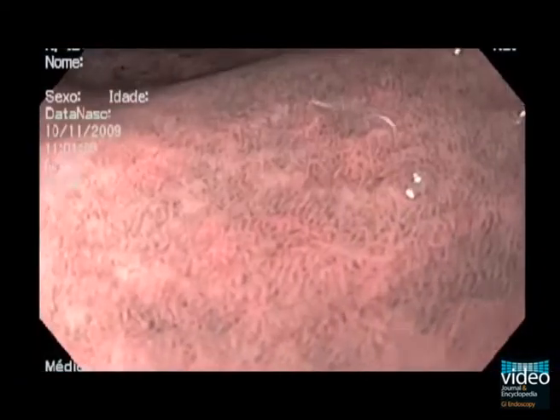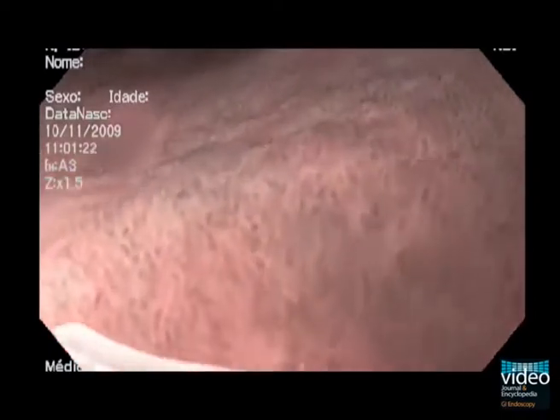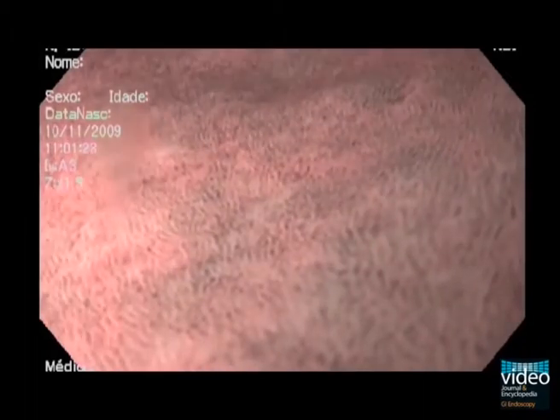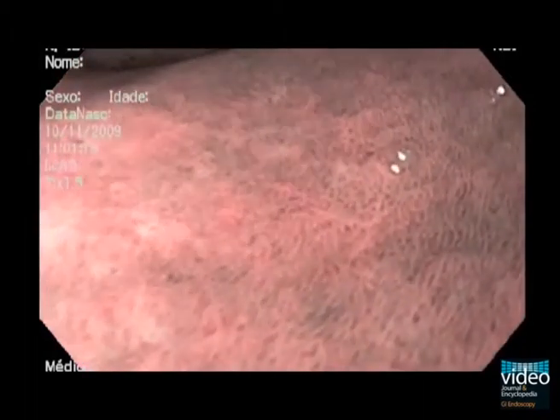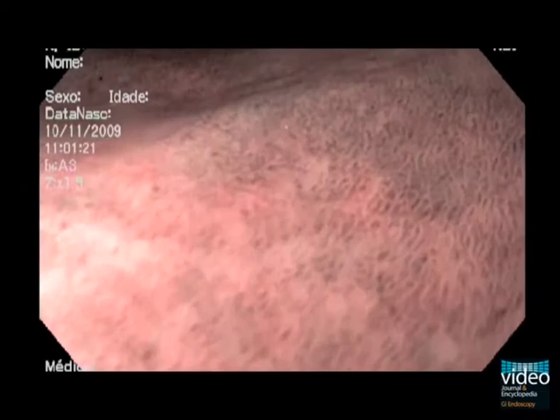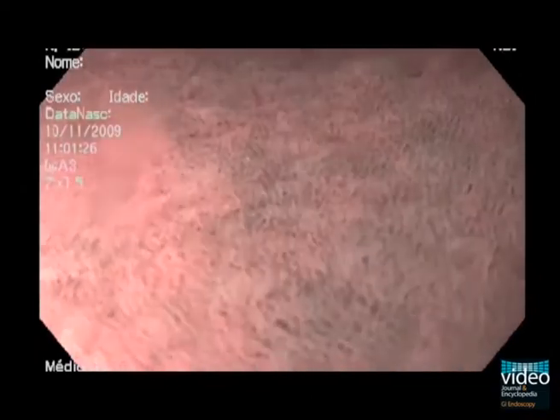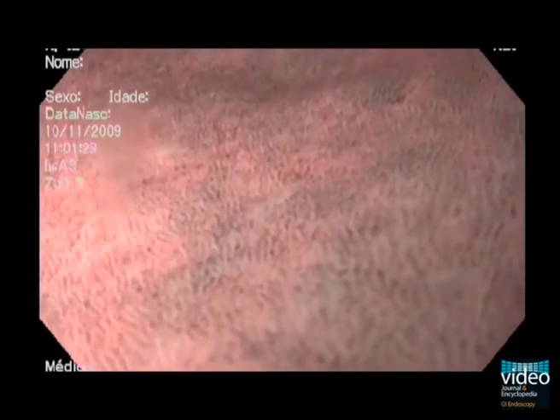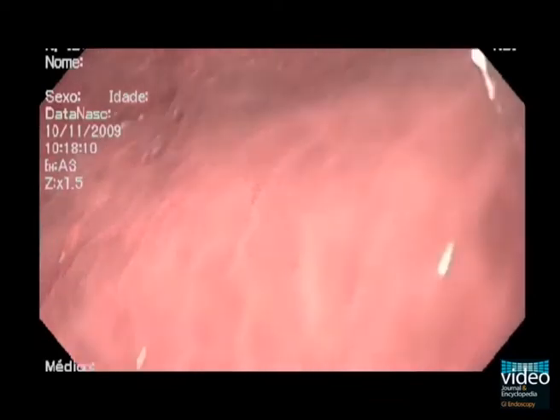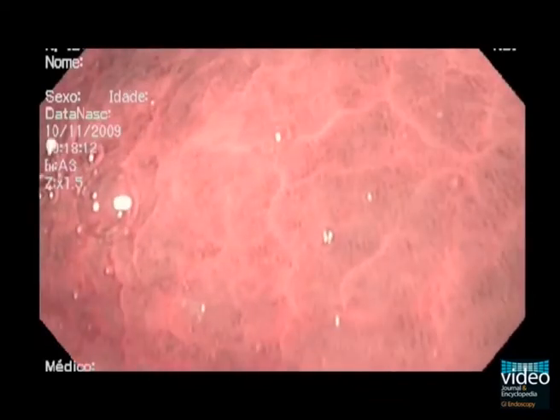H. pylori gastritis is suggested by a variable vascular density with areas of low density (lighter areas) and high density (darker areas). These areas of low or high vessel density may render the visualization of NBI features difficult; however, they should not be confused with the irregularity seen in dysplasia. Even in areas of metaplasia, gastritis should be suspected with this pattern.